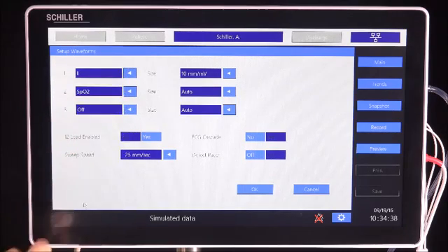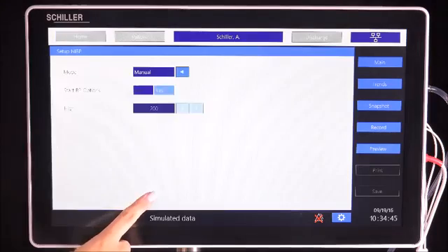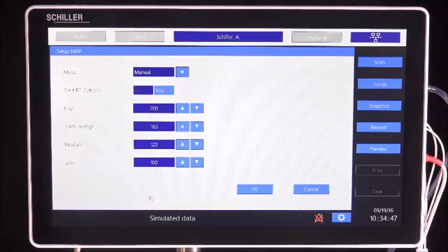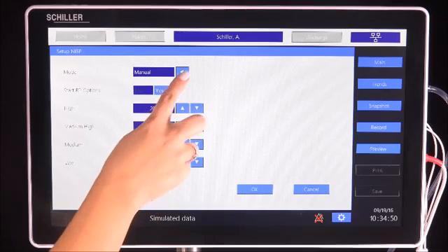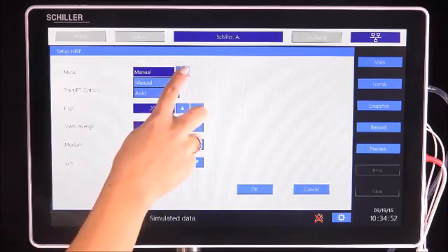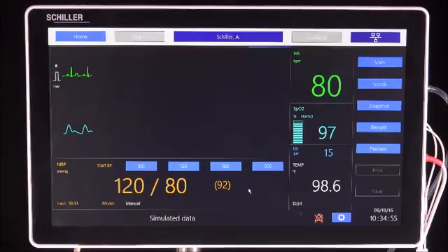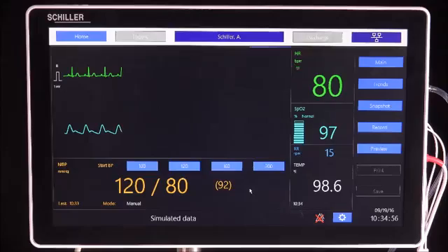and the option to turn a waveform off is also available. Below the waveform area is the blood pressure. By tapping on the blood pressure area, the settings for NIBP open. Here you can set the blood pressure measurements to be manual or automatic and adjust the low, medium, and high values. To take a manual blood pressure measurement, select the initial systolic number and the measurement will begin.